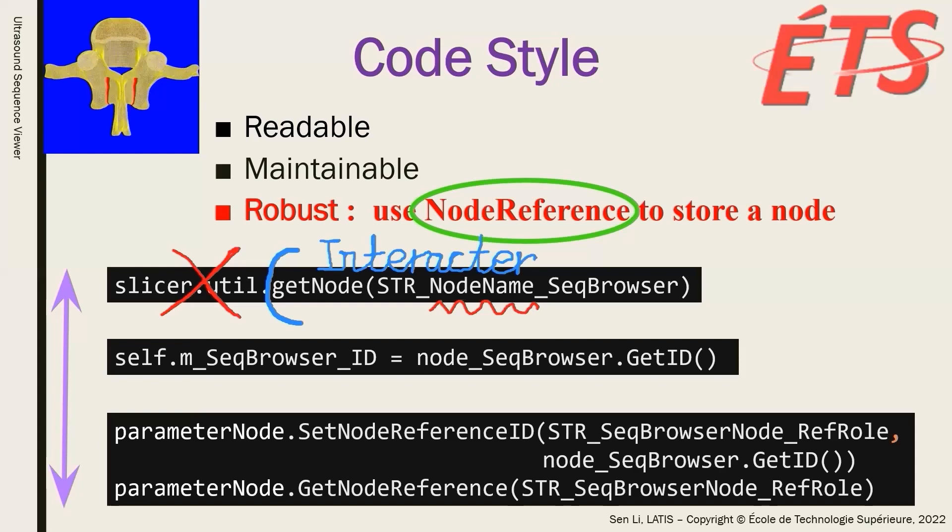The second method to get and store a node is using the node ID. However, it can be fragile because the 3D slicer automatically modifies the node ID when loading a new sequence file. It can be fine using the node ID within one method call, as the user cannot add or remove nodes while a method is running.